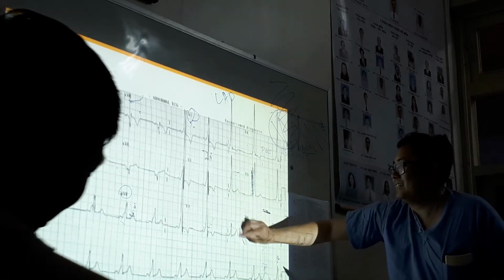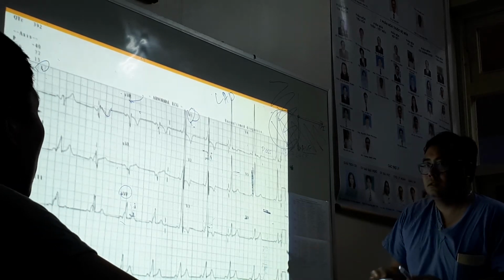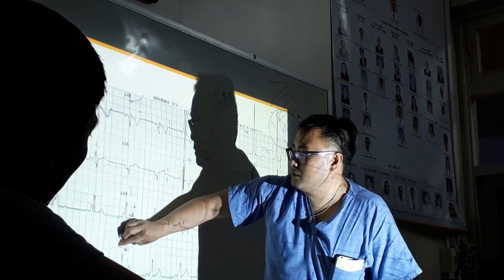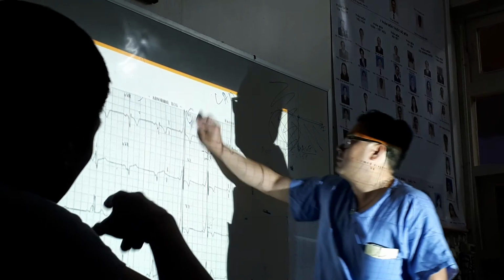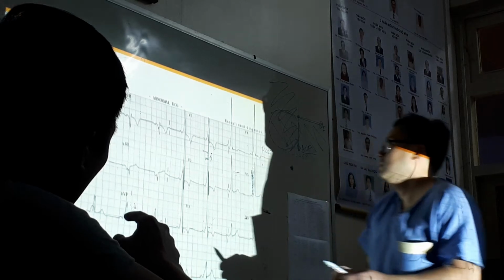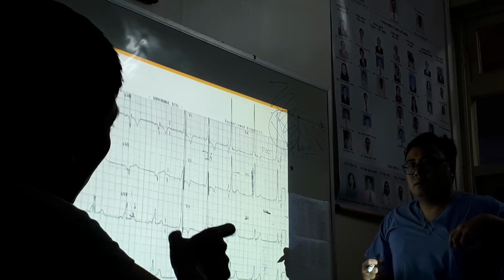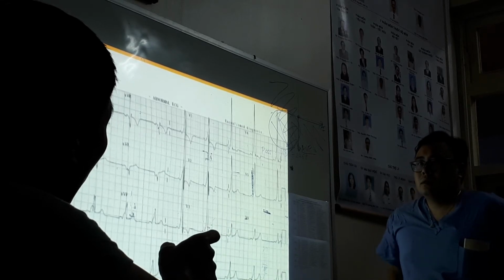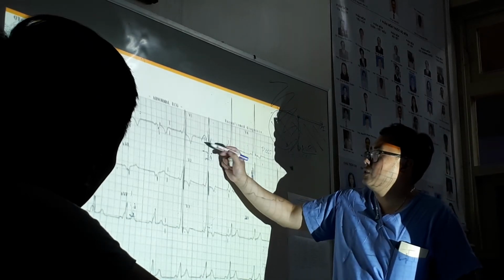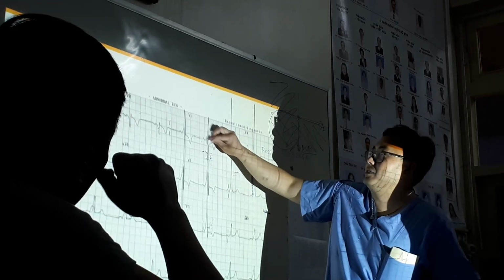I have a question then. If the patient has left atrial enlargement, atrial enlargement, yeah. This may increase the time of the P wave. This means that, for example, in this situation, if they have left atrial enlargement together with Wolff-Parkinson-White, the PR interval can be longer than 0.2. Oh. You see that? Yeah, because atrial enlargement normally looks like this in any lead. I don't know how to answer that.